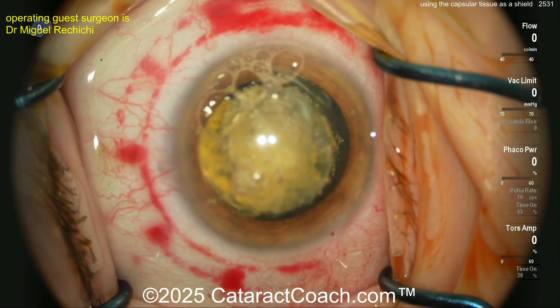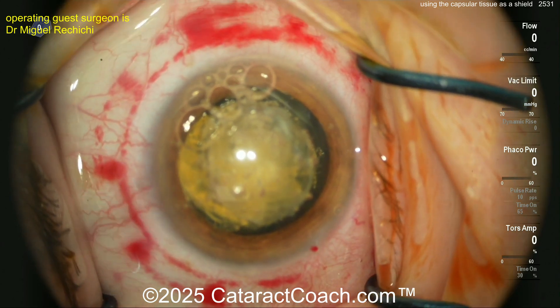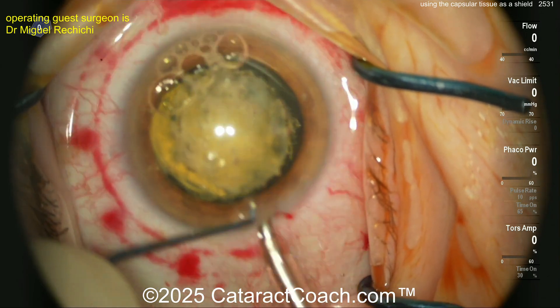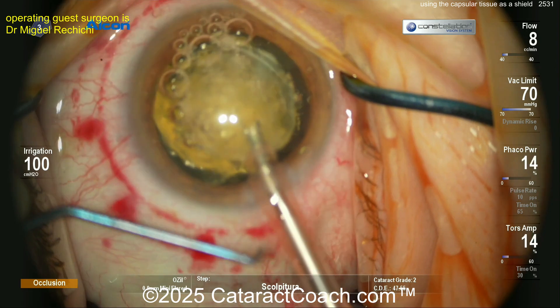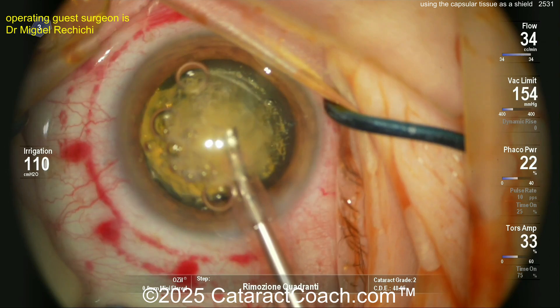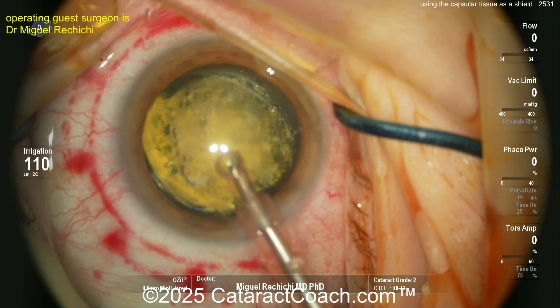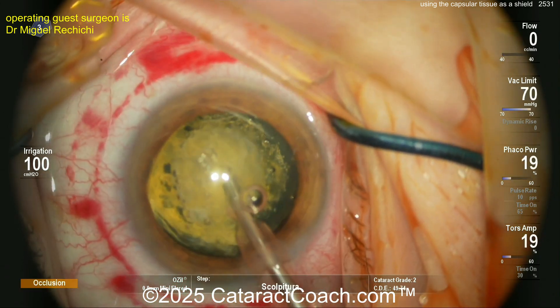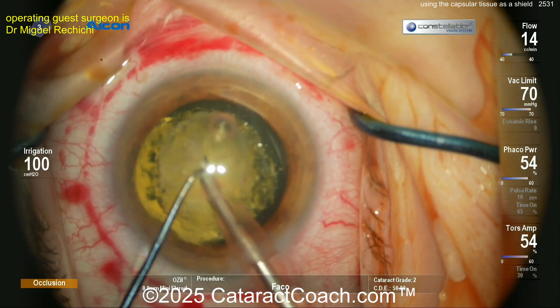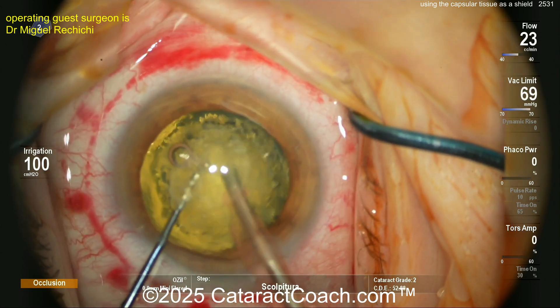Now let's get to the cataract surgery itself. You're asking about all that subconjunctival hemorrhage — that's from the femtosecond laser. The phaco incision has already been made with the keratome. Going in with the phaco probe, you have viscoelastic already lifting up the anterior capsule — that central five-millimeter button — up against the corneal endothelium. The tissue is pressed up against the corneal endothelium with a viscoelastic barrier to protect the cornea.